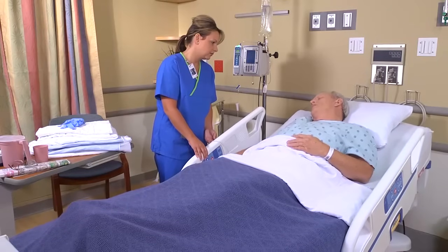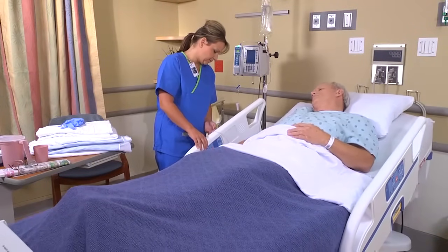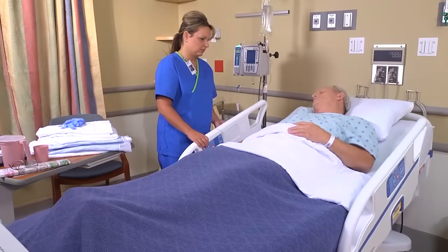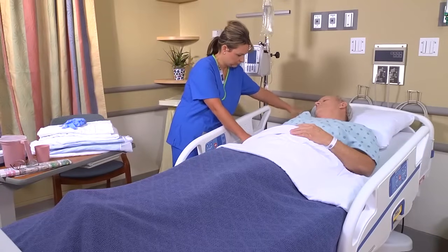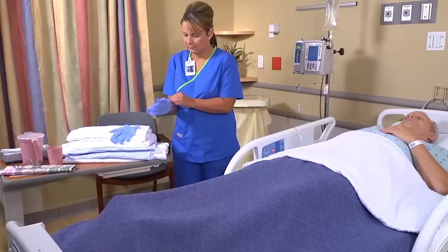Do you do okay lying flat? — I like my head up a little bit. Raise the bed to a comfortable working height and lower the head of the bed as much as the patient can comfortably tolerate. If the patient is on aspiration precautions, keep the head of the bed no lower than a 30-degree angle. Put on clean gloves.